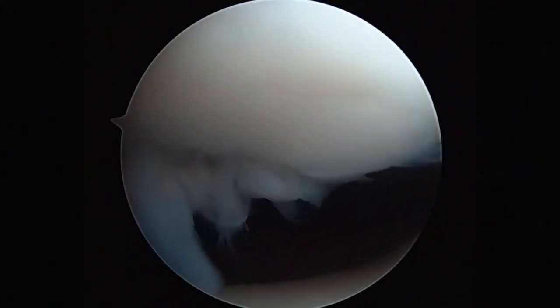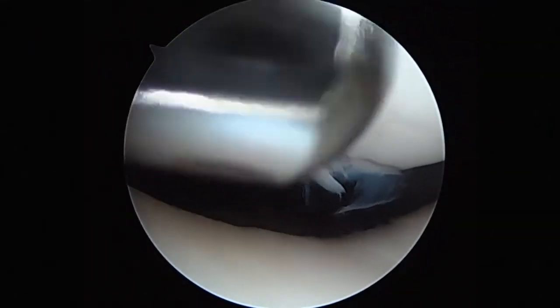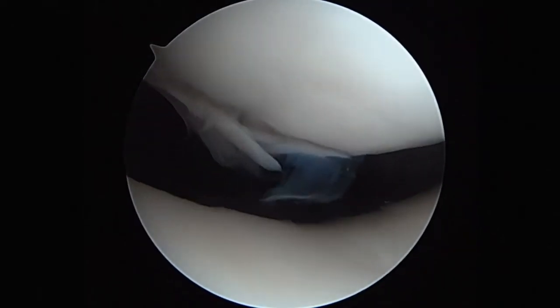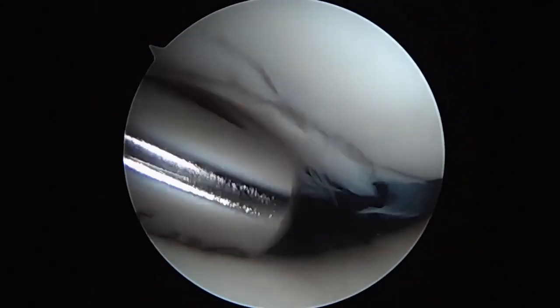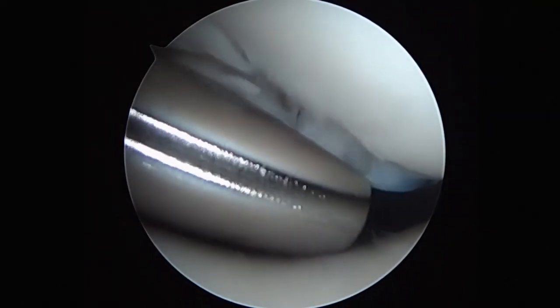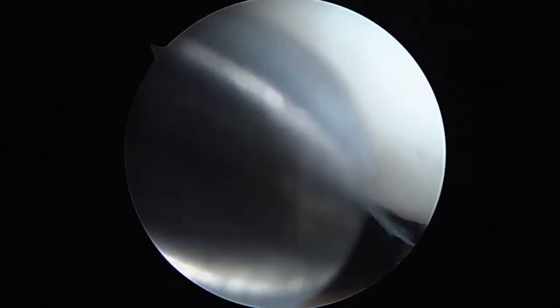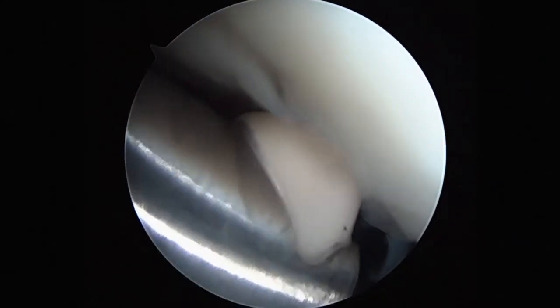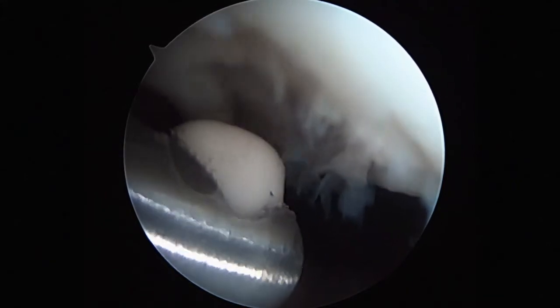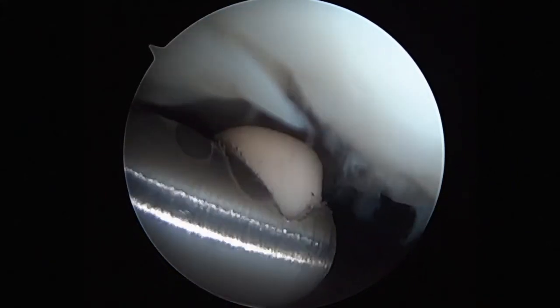The chondral area is assessed and then dealt with appropriately, initially with the 4.5 angled chondratome. This is to initially debride any loose chondral surface. The rest of the technique using the radiofrequency ablator enables improvement of the stability of the chondral surface without damaging normal components of the chondral surface.